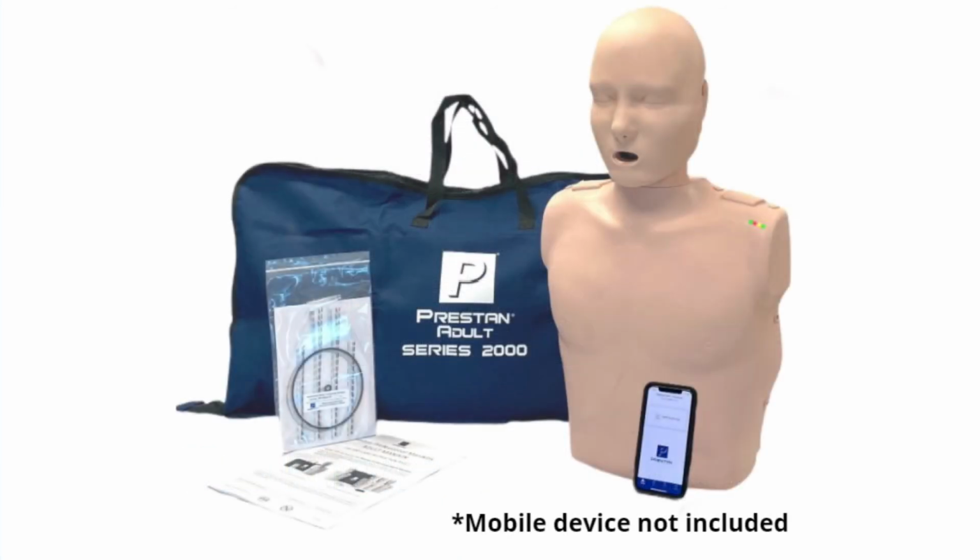For more information on the PRESTAN Professional Adult Series 2000 mannequin, please reference the instruction sheet, troubleshooting guide, and frequently asked questions, available on the PRESTAN website at prestanproducts.com.